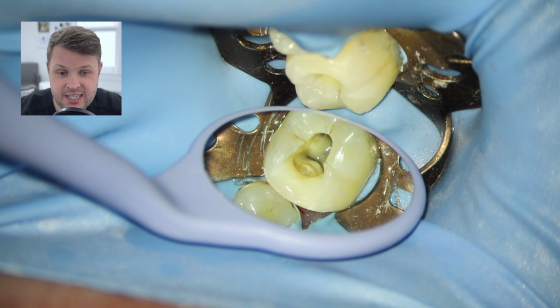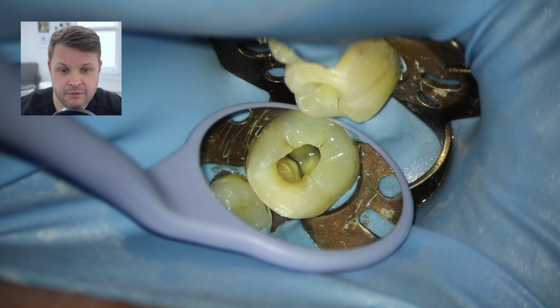And as you can see here, this is a really nice restoration. It also makes sure that right at the end of the appointment, you don't want to be messing around with all this. You want to just get this boxed off straight away, so when you finish the root canal, you've spent 2 hours, you're tired, you can just fill the space up and then you're done. So making sure that you put a filling in a tooth and make it solid has many different applications and reasons.